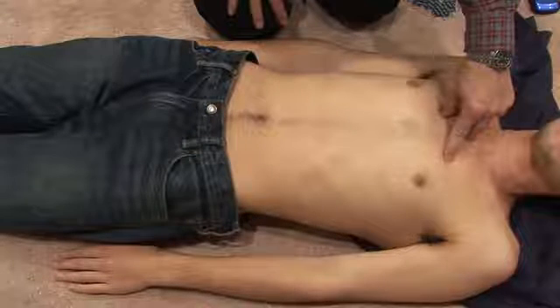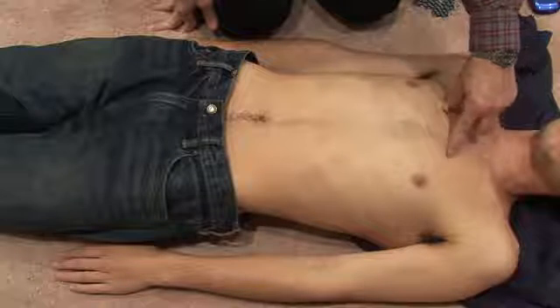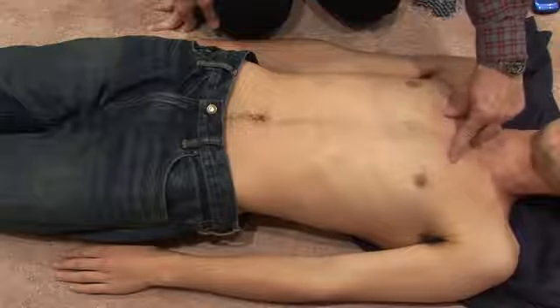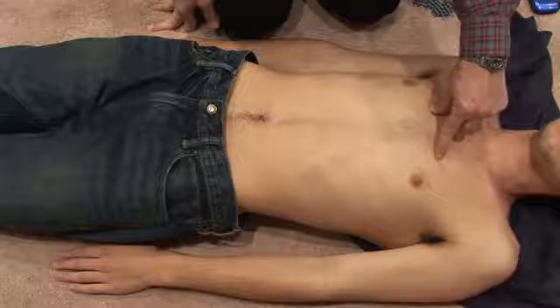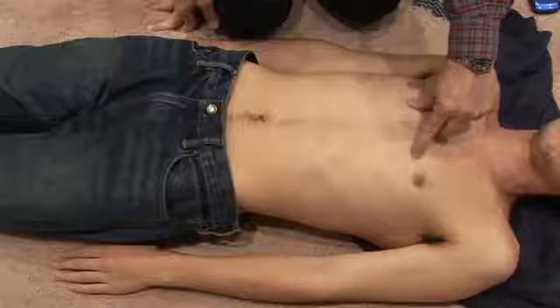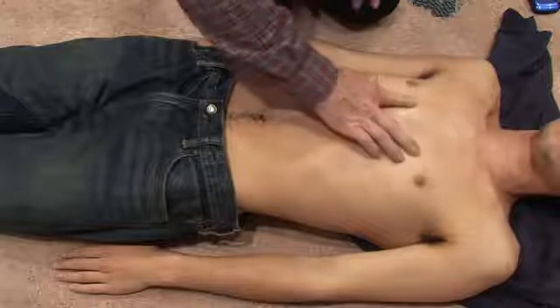Now, where do the ECG electrodes have to go in? The fourth intercostal space. So find the sternal angle, find the second rib, move down slightly, and you feel that little hole there. That's the second intercostal space. And then run over the third rib, the third intercostal space, the fourth rib, and then the fourth intercostal space. So if you find the fourth intercostal space, that's where V1 and V2 go.